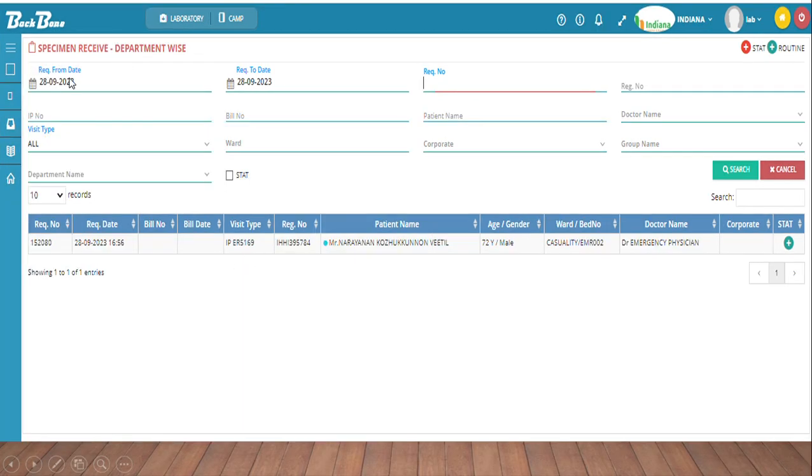Again same thing, the date, then request number, register number, all those things. Usually since only 4-5 samples are collected at a time, only those many lines will be present, and this will be collected if you are sitting in the OPD down in the S6 area of the ground floor. Once this sample goes to the third floor lab, only there will they collect this particular sample.